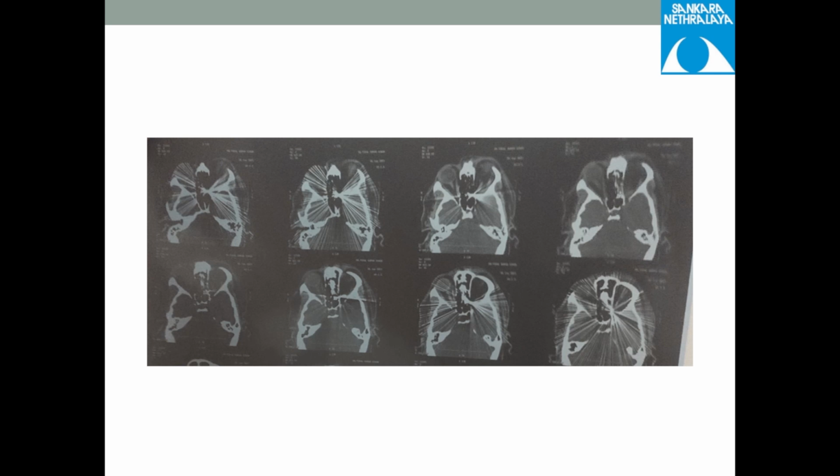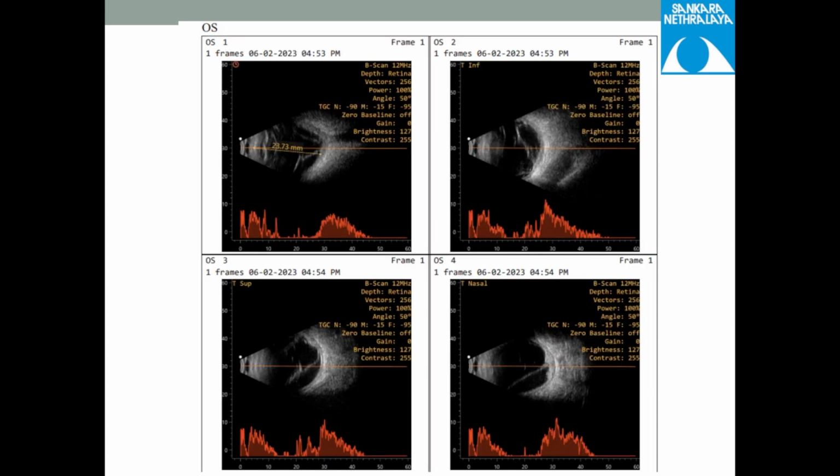These are the artifacts, but multiple pellets were seen in the orbital apex of the left eye and the medial orbital wall. Ma'am, this is an ultrasound of the left eye. The first scan is an axial scan, which is showing a lens echo. And there is a membranous echo extending from the ONH to the periphery, and mostly I can see it in all the quadrants, and it is of moderate to high reflectivity. Now, I cannot comment about the after-movements, so it can be retinal detachment. Usually the thickness looks like a retinal detachment only, other than a vitreous.